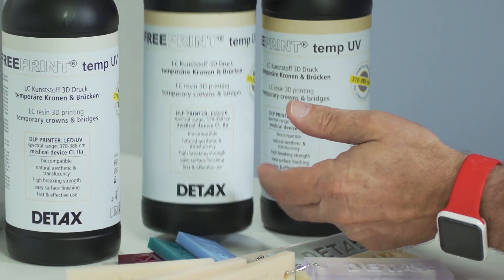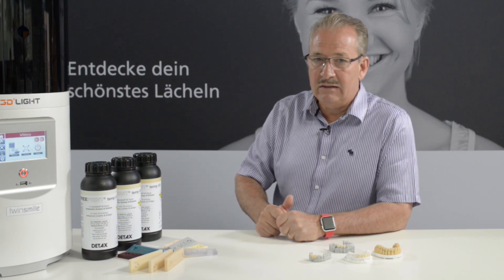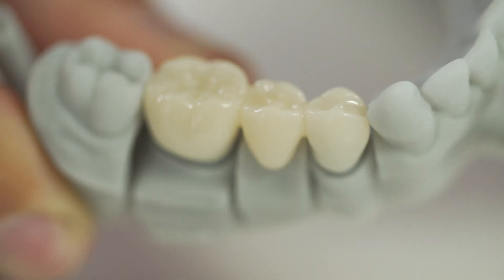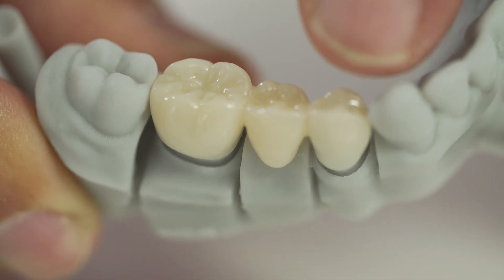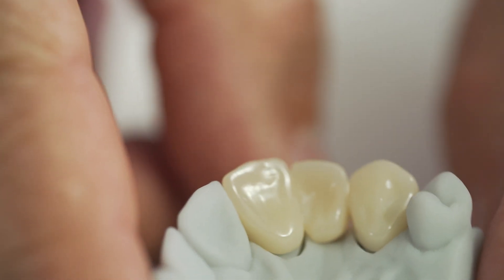It's a product which is Class 2A, that means it fulfills all the medical regulations. The material is very nice in its translucency. It is abrasion resistant, meaning it's strong enough for all temporaries, and the temporaries can be produced very, very fast.